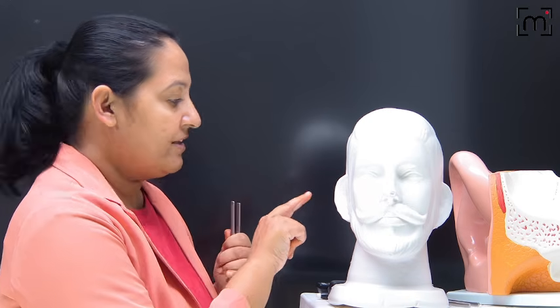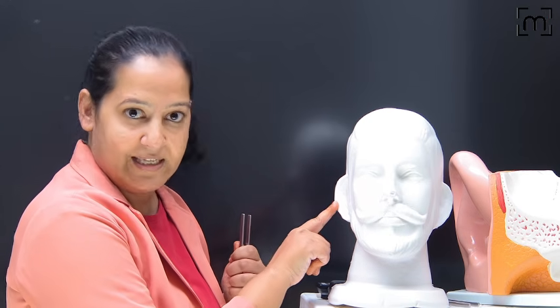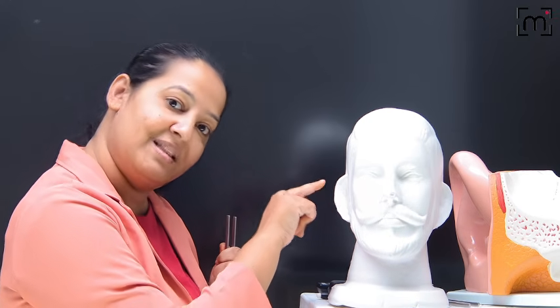Let's perform. I'm the examiner, I'm the doctor, and this is my patient. I'm performing Rinne's test on my patient. My patient is having trouble in the right ear. This is the right ear of my patient. Suppose I'm the ENT specialist. So I will do Rinne's test first. In Rinne's test, this is my patient's diseased ear. I will do AC and BC in the same ear and compare AC with BC.